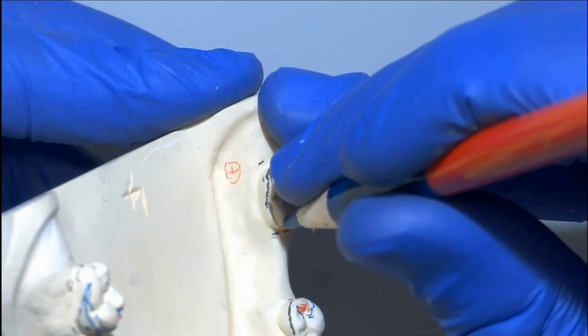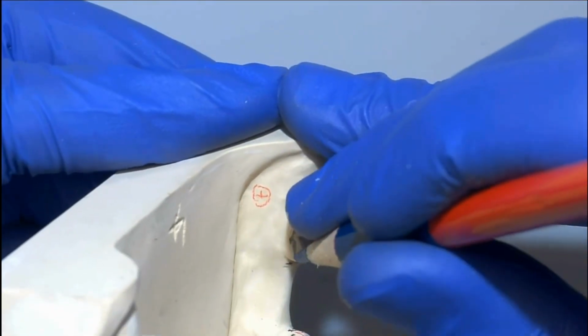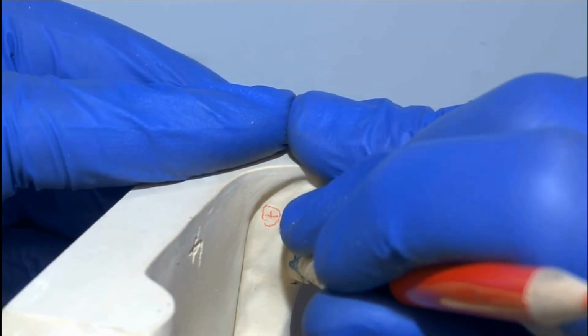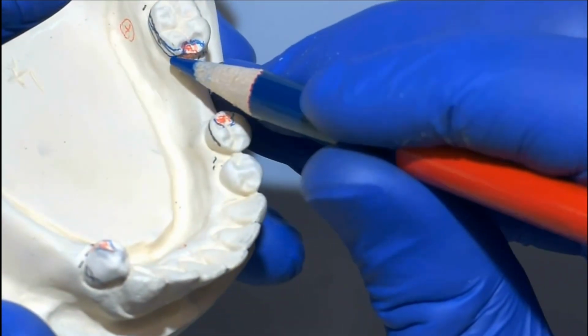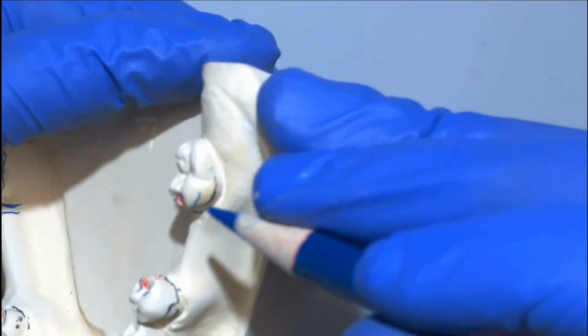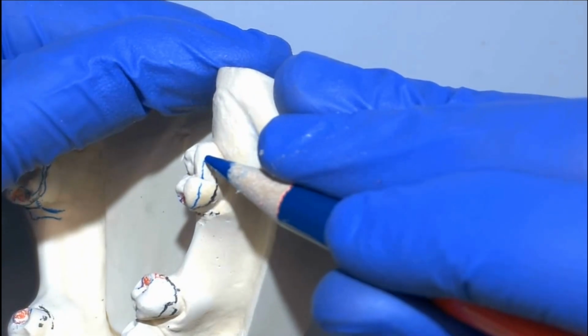Next, we're going to start drawing the retentive clasps. It's important to note that retentive clasps remain occlusal to the height contour up until the terminal third, where they engage the undercut. Reciprocal clasps, however, remain occlusal to the height contour for the entirety of their length.